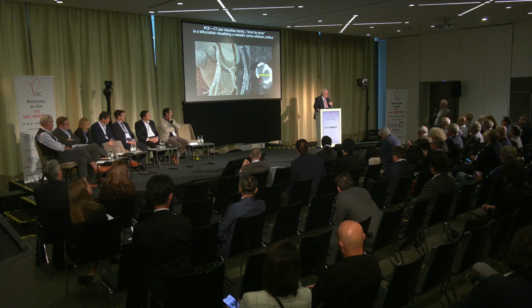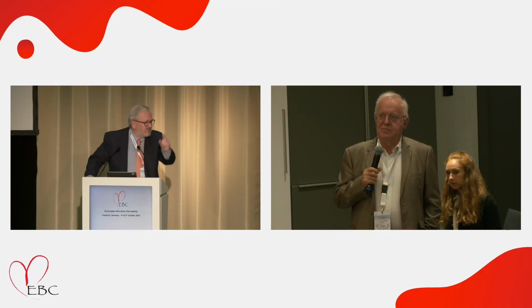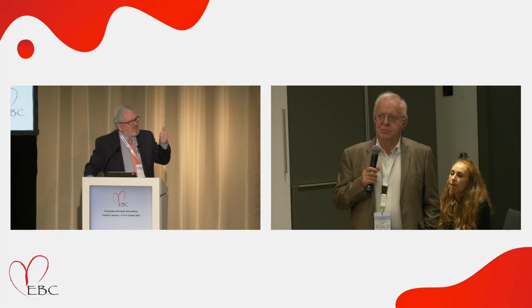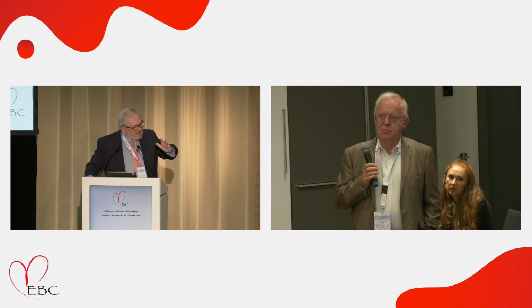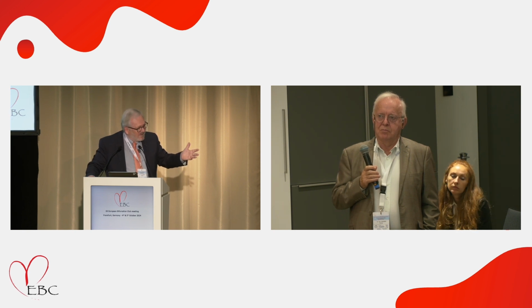And the image we got in the core lab is so clear that over the shoulder of the fellow I can say, oh, that's a photon counting. Yes, sir, it's a photon counting. So that's point number one. 111 micron. That's somewhat better than some old IVUS. It's better than coronary angiography, which is 200 micron.